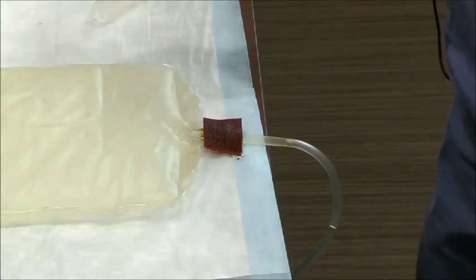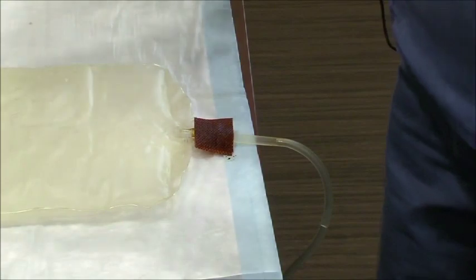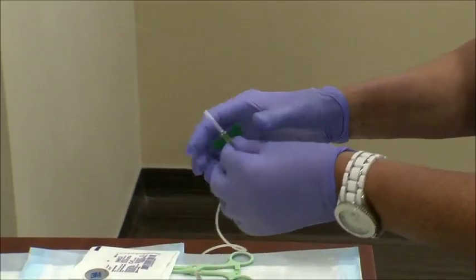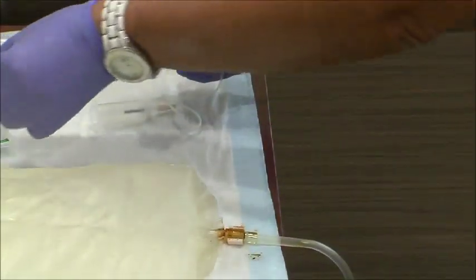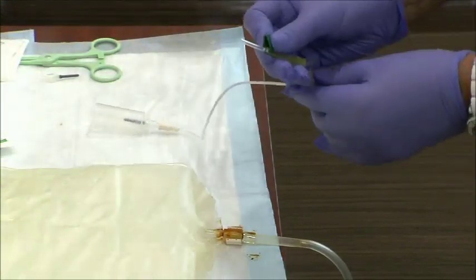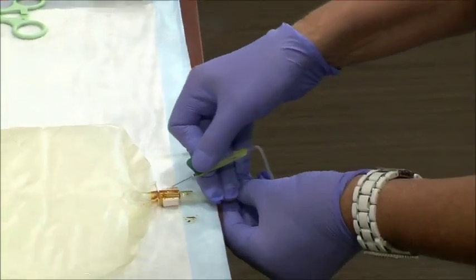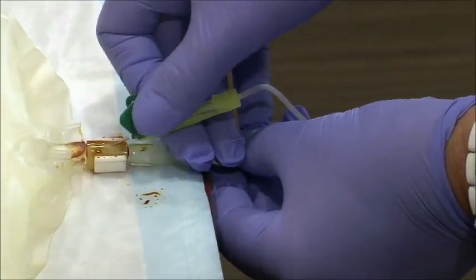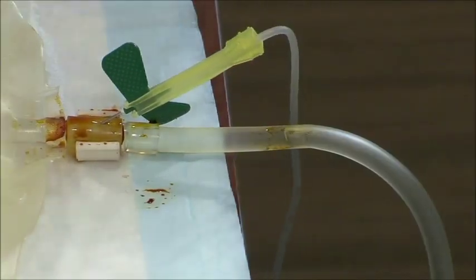I suggest the 21 gauge or bigger if you have it. It's hard to draw up. This is the port, as I said. You remove the betadine and without touching or contaminating, we enter without going all the way through. The butterfly twists sometimes.